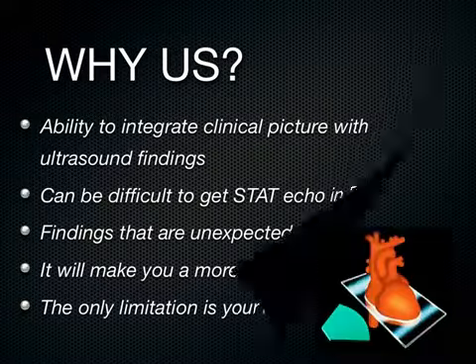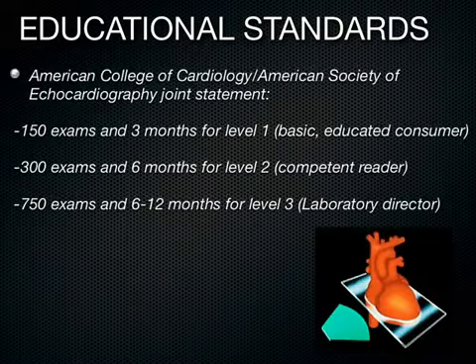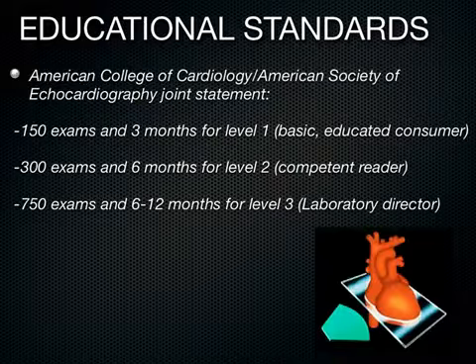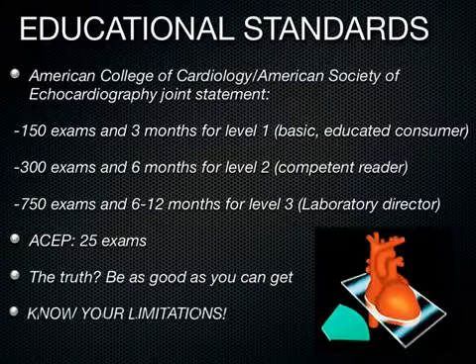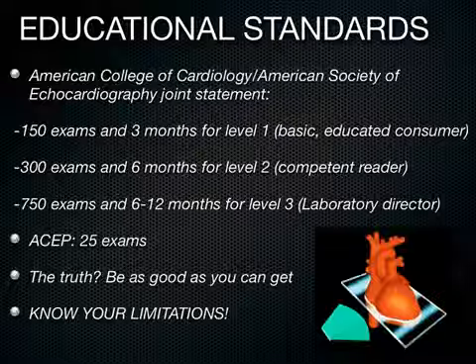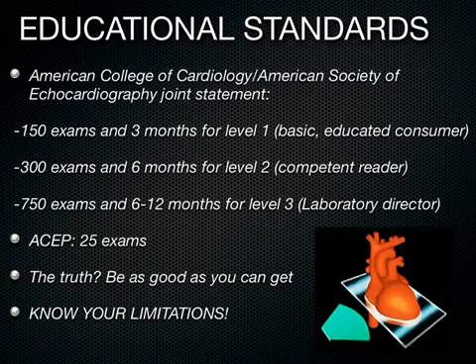So that's a good reason to be doing this stuff. There's all these educational standards out there from the American College of Cardiology and the American Society of Echo, but the American College of Emergency Physicians wants 25 exams. The idea is you want to get as good as you can and start to understand some of your limitations with cardiac ultrasound, which we'll get to.